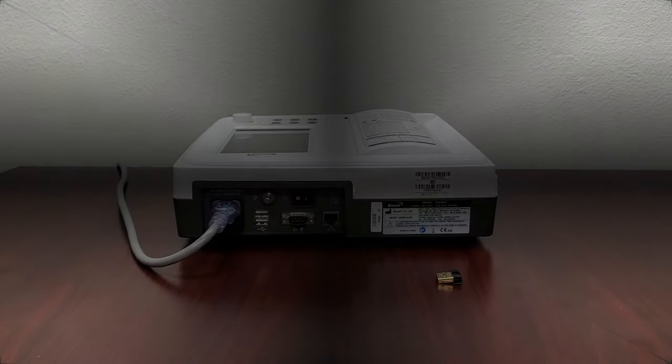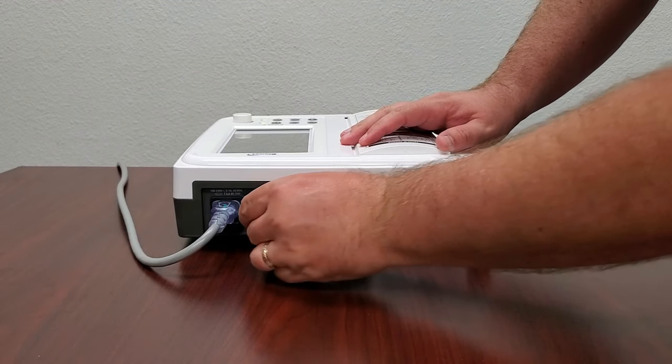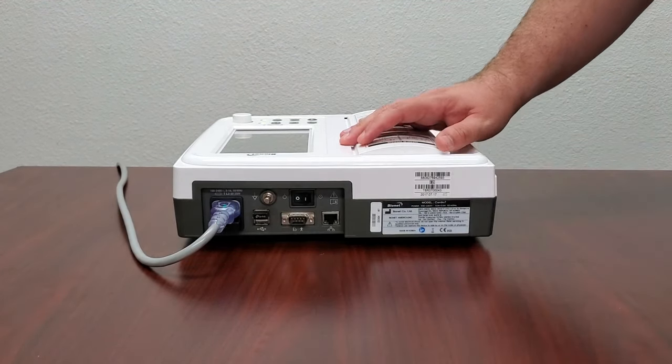The second way to connect your Cardio 7 is through a wireless connection. This process will be very similar to the wired connection, but with a few extra steps. Begin by ensuring that your Cardio 7 has a Wi-Fi dongle installed in one of the USB ports on the back of the machine. Your machine cannot search for a wireless signal without it.